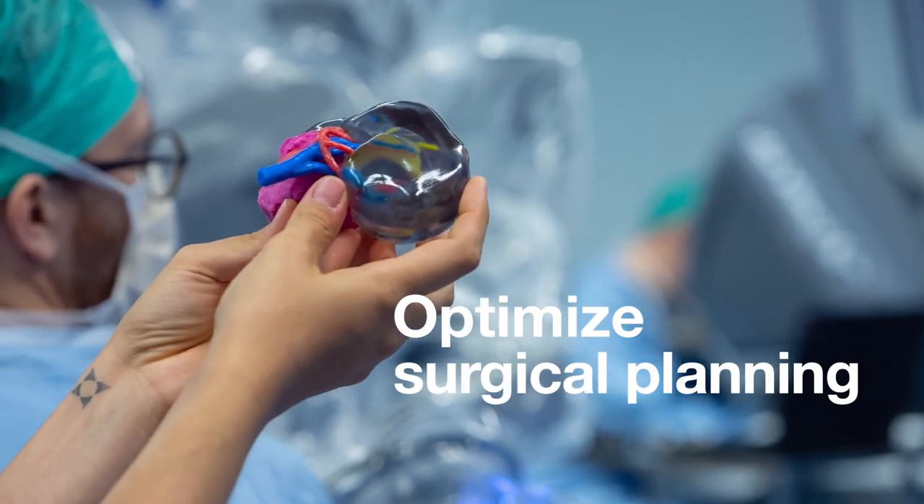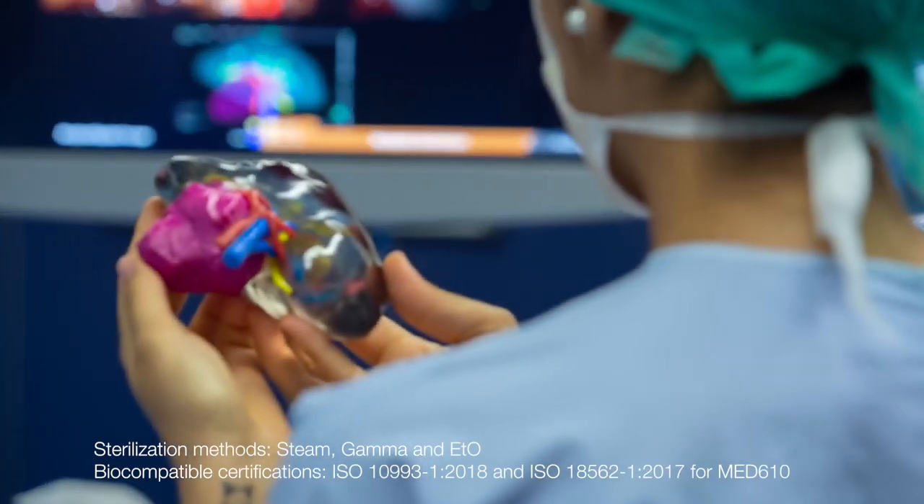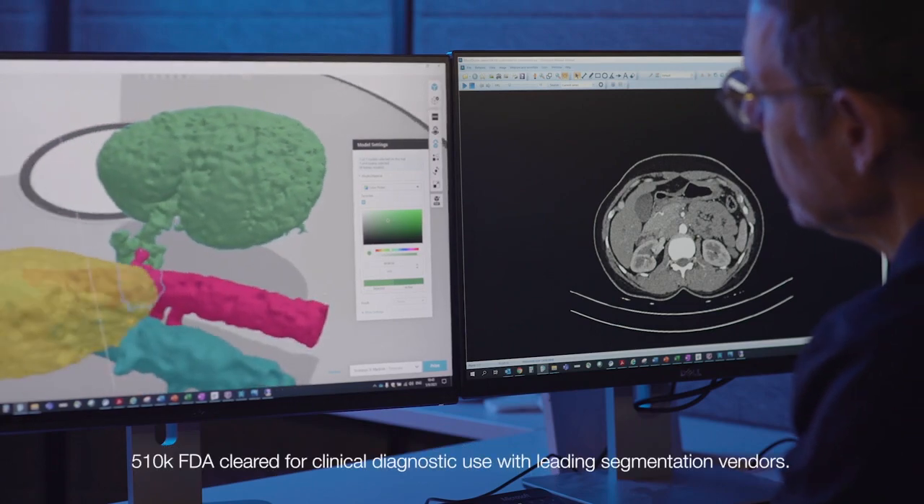Optimize surgical planning with visually customized, physically accurate, sterilizable, and biocompatible models based on patient scans.